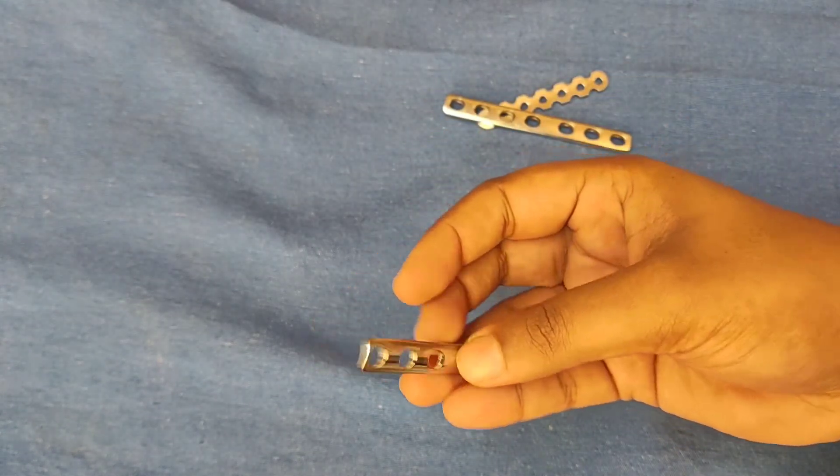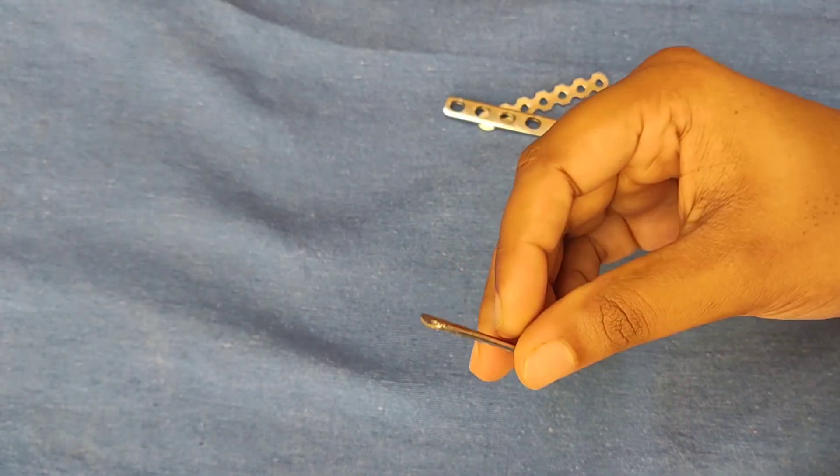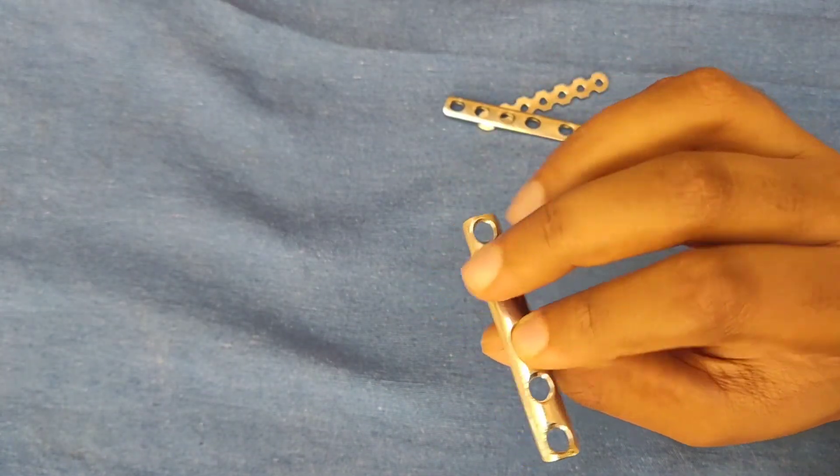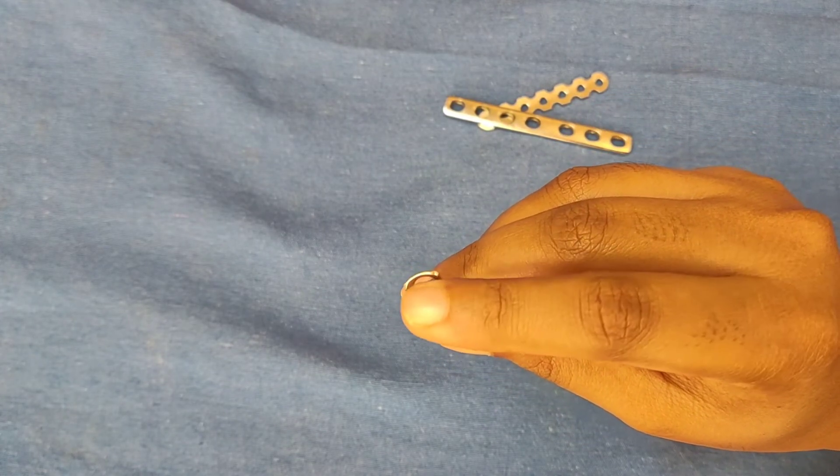Quarter tubular means one fourth of circumference of a cylinder. One third means one third of circumference of a cylinder. Semi tubular means half of circumference. One third tubular plates are mainly used for fracture fibula fixation.